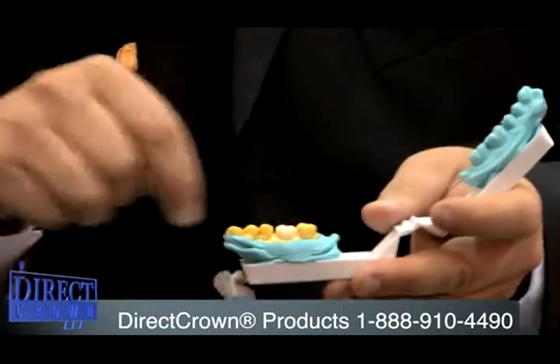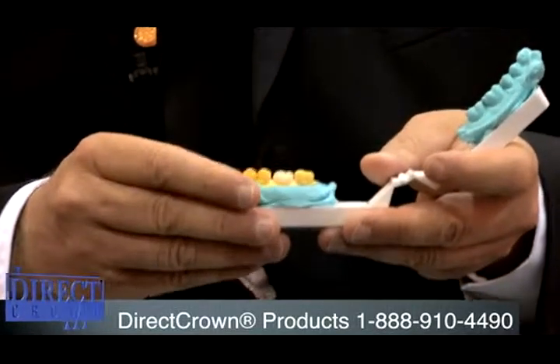Generally, it's a product that you can get from Parkell. By placing the bond inside of it, and then whatever lining material you decide to choose, whether it be the acrylic or the bisacryl, you can line the DC2 crown shell with that and go right directly to the mouth. With the bisacryl application, you're going to draw it out when it's in its rubbery form. If you're fabricating a composite crown shell, if you want a long-term restoration, you're going to be putting composite on the inside of the shell.